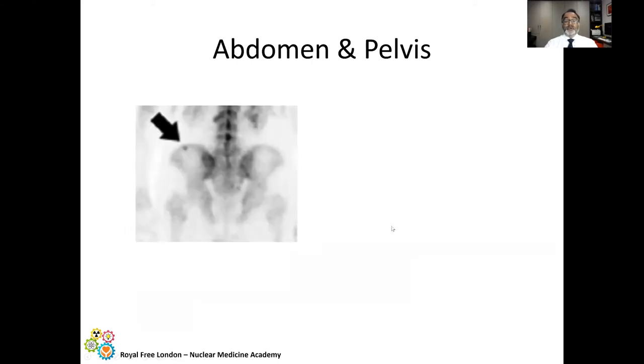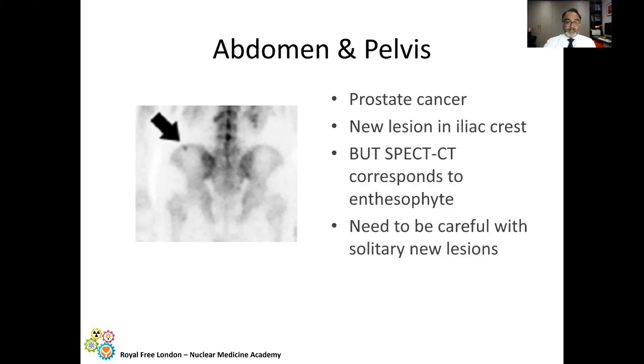Here, there's very focal increased uptake in the left iliac crest. You might think, okay, this is straightforward. This is a staging scan, so this is going to be a metastasis. Well, unfortunately, a SPECT CT was performed, and fortunately for the patient, it turns out to be an iliac crest enthesophyte.